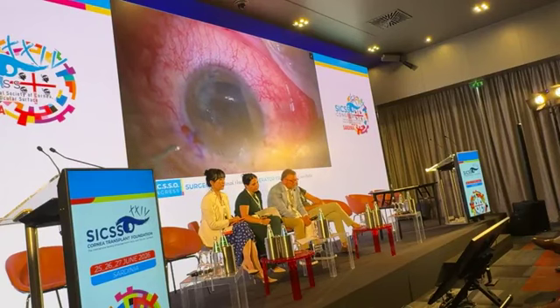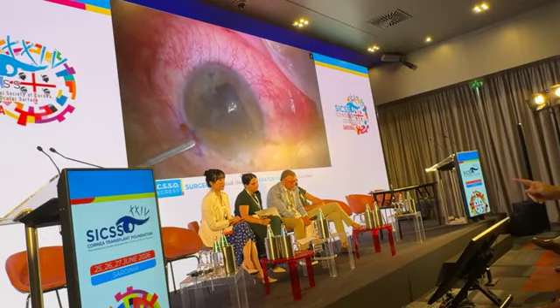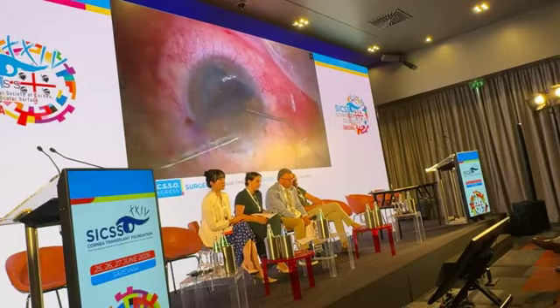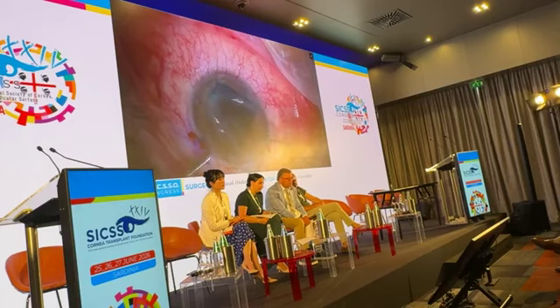He's also using some pressure on the center of the cornea to try to keep the graft in position while at the same time tapping to help the unfolding. You can see the marks on the outside of the cornea that were made at the beginning of the surgery. The marks are at an 8.5 millimeter size, while the graft that has been transplanted is 8 millimeter in diameter.